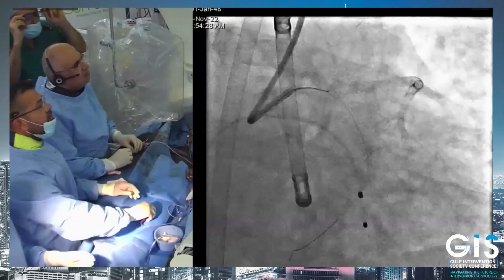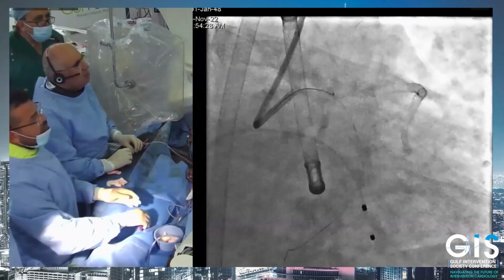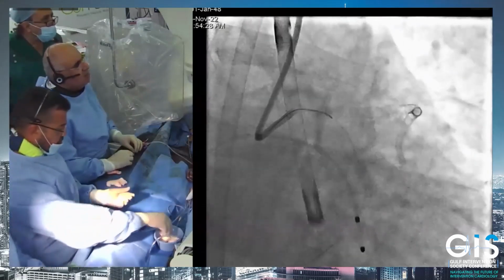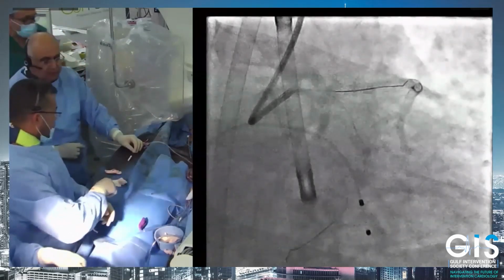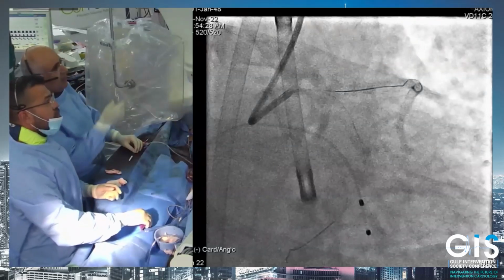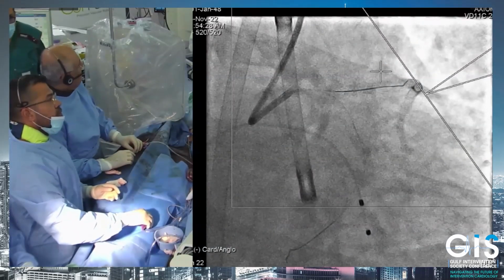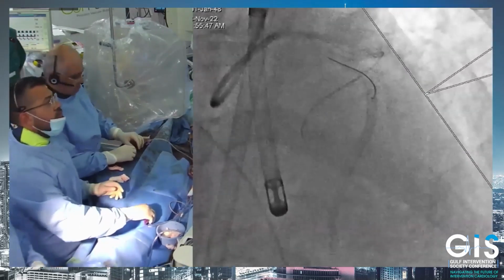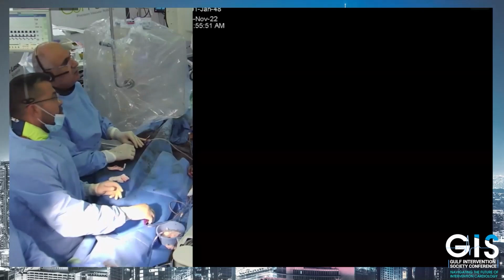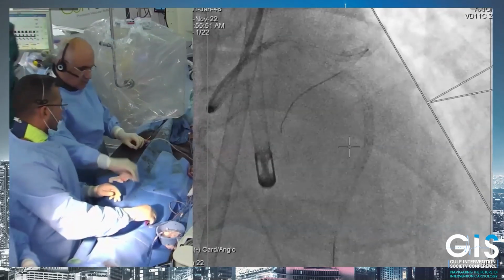Abdullah? So yeah, this is where sometimes unanticipated events can distract you a little bit, and that's what happened with the OM. The difficulty here is multiple steps. One of them is planning what to do with the ostium of the LAD and whether or not the left main is involved. Wiring was expected to be difficult, but greatly done here.